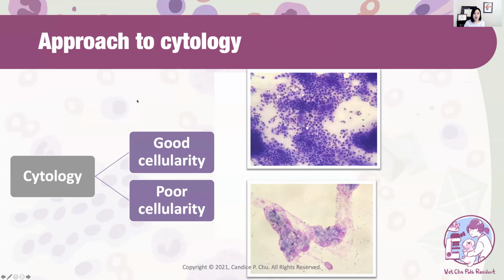So go to the main point of today's talk. We will be talking about how to approach cytology. The reason why I want to teach this is to teach you an organization that can be applied to all of your future cytology samples.